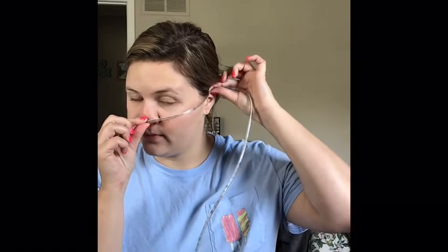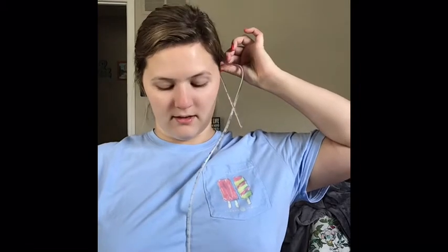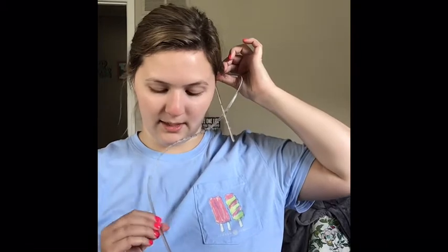Okay, so I'm going to take the tip here and hold that to my earlobe. Then I'm going to pinch at my earlobe, and then go to my xiphoid process here. And I would say I'm right at about 70 is where I am.